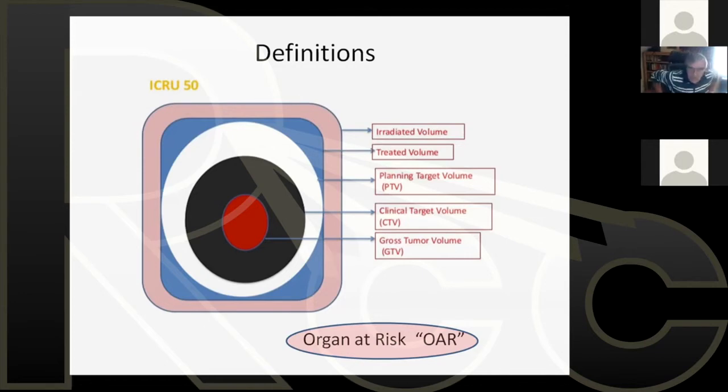There is also another acronym called OAR. That stands for organ at risk. That is very important in detailing, outlining, quantitating how much dose is delivered to organs which should not be treated.